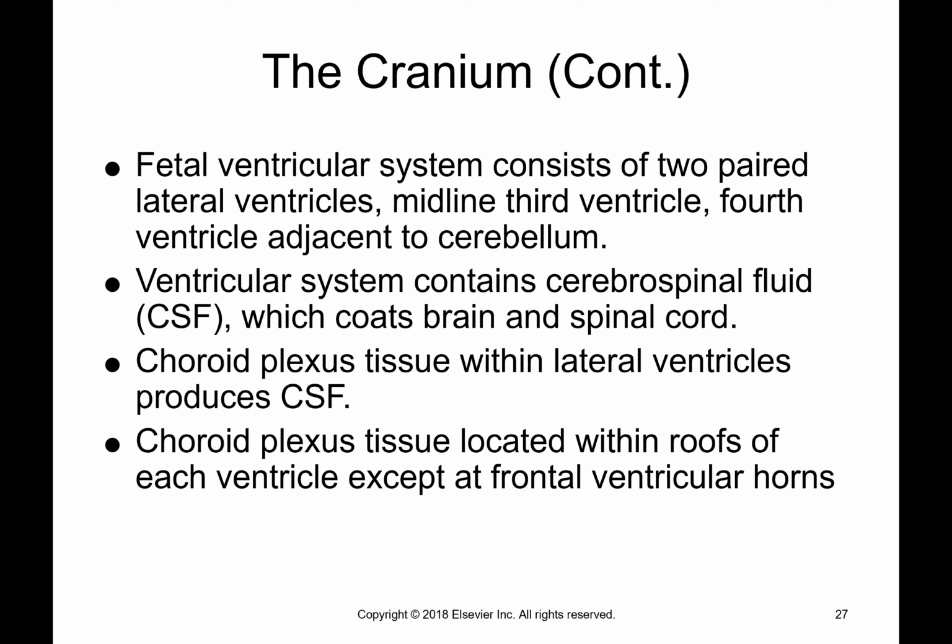The fetal ventricular system consists of two paired lateral ventricles, a midline third ventricle, and a fourth ventricle adjacent to the cerebellum. Usually the third and fourth ventricles, you don't routinely look at when you're doing a complete scan because they're pretty small unless there is something going on.